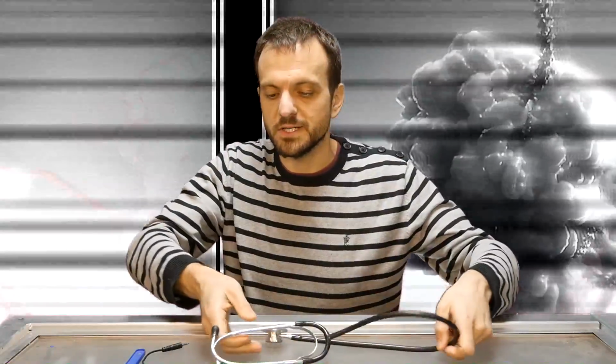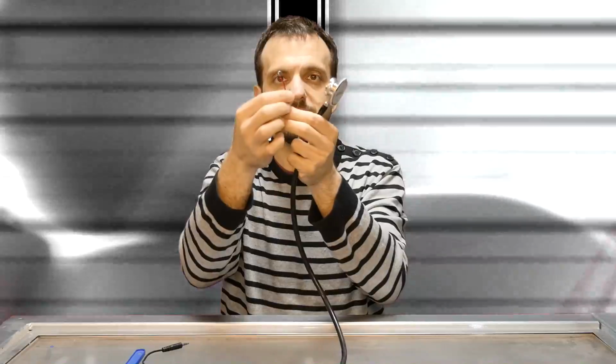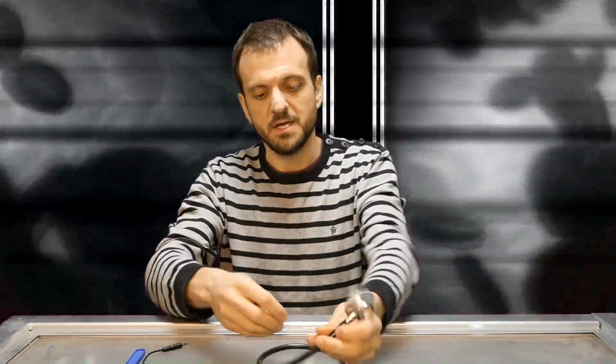So I'm going to use a few bits and pieces. I'm going to use this stethoscope and this little teeny microphone, and I'm going to build a sort of digital stethoscope so that you can listen to your heart, record it and then analyze it on the screen, and hopefully you'll be able to hear my heart. It'll hopefully still be going after I've played with all these electricity things. Let's jump into the lab and have a play.